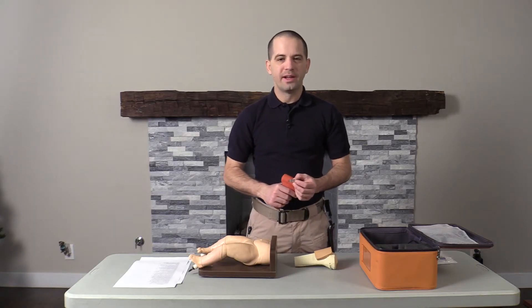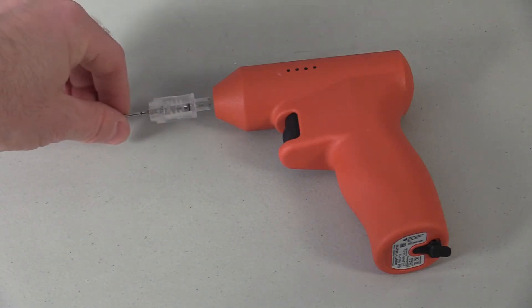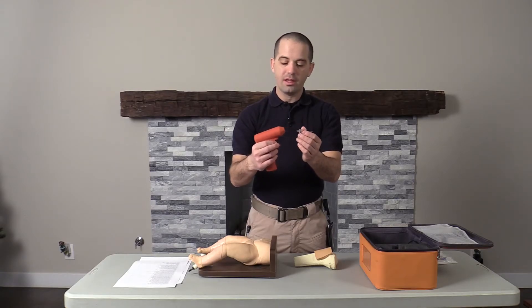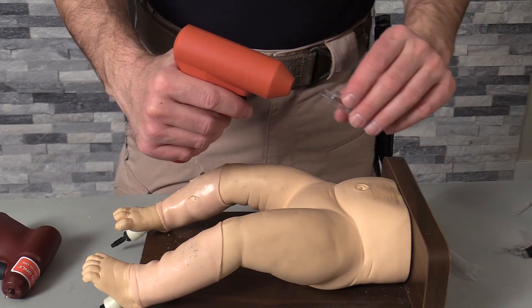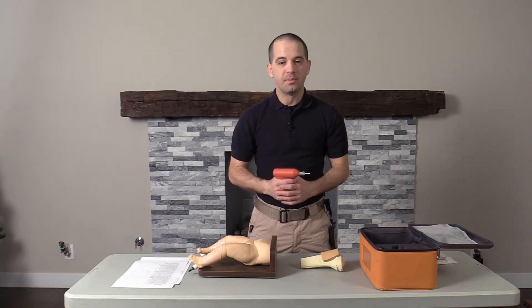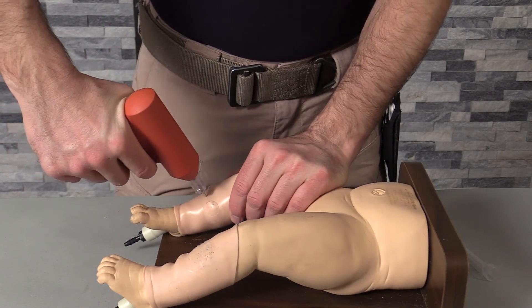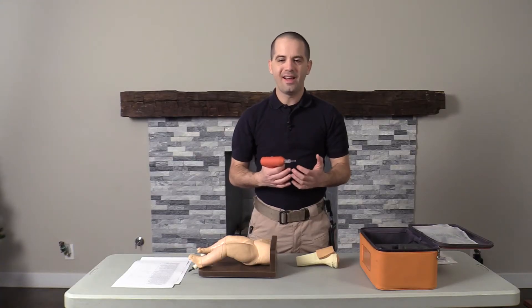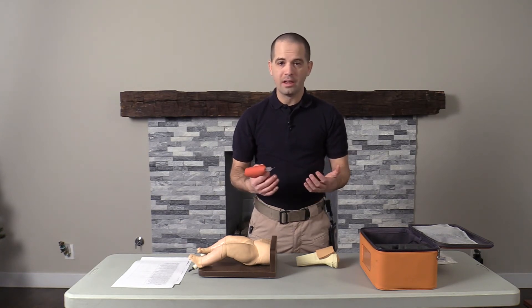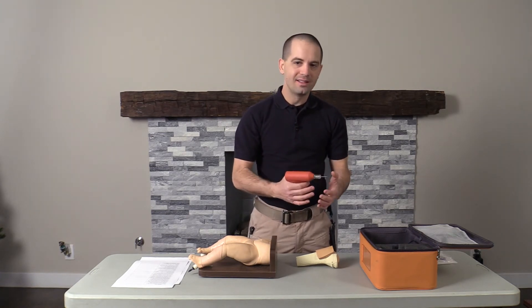Now let's talk about getting ready to use the device. You will notice that the needle actually slides into the driver — a little bit different than some of the other drivers on the market, which have it the other way around where the driver slides into the needle. I feel that this actually secures the needle a little bit better. As for placement, we can place these needles anywhere the other drivers can go, including the tibial plateau or the humeral head. Let's compare both the BD I.O. driver and the EZ I.O. driver and take a listen to how they sound.